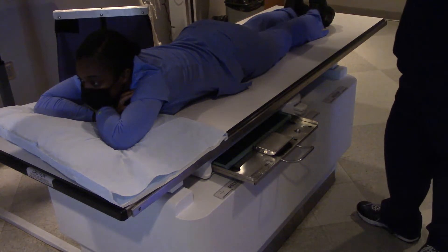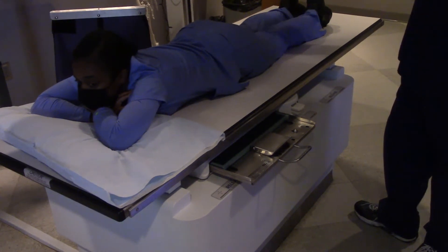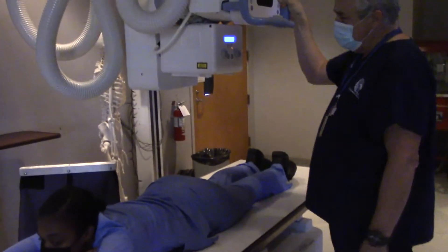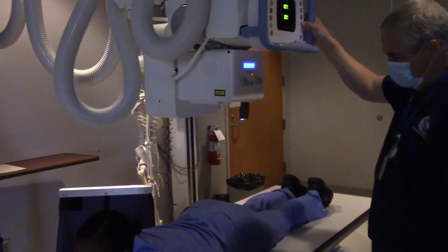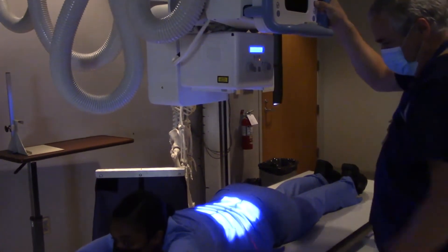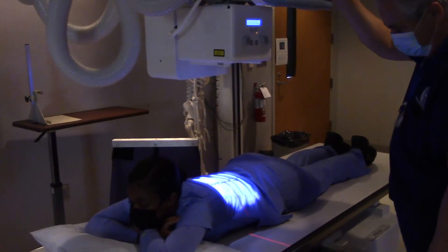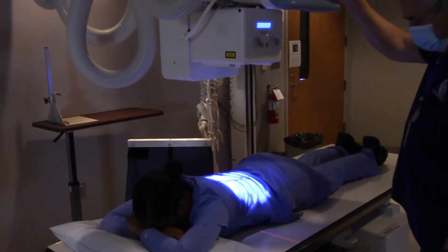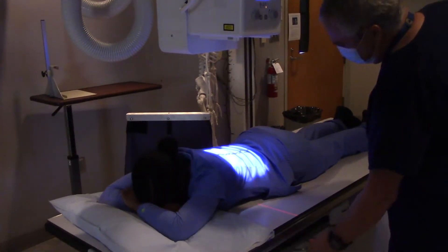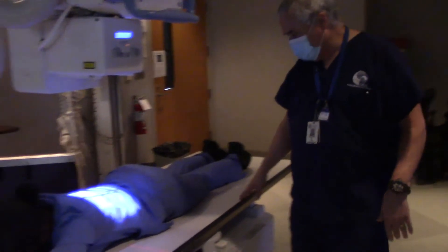So the first thing I'm going to do — and you can do this at a different SID — but the way we teach it is with a 40-inch SID. What I'm going to do is take a radiograph of this person's esophagus. Now ordinarily, the esophagus does not show up on an x-ray. We can't see it, unless of course we have some barium on board.